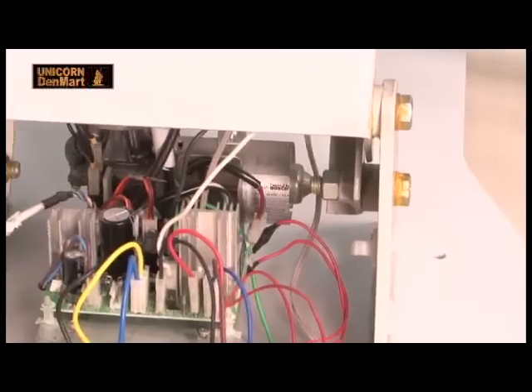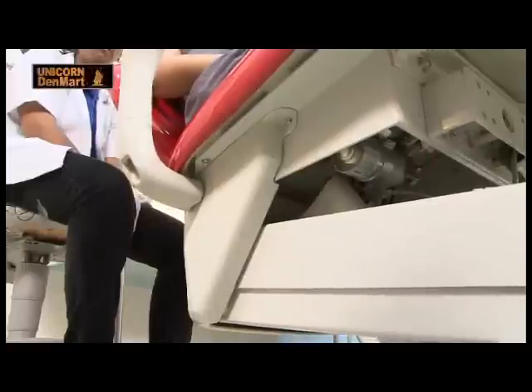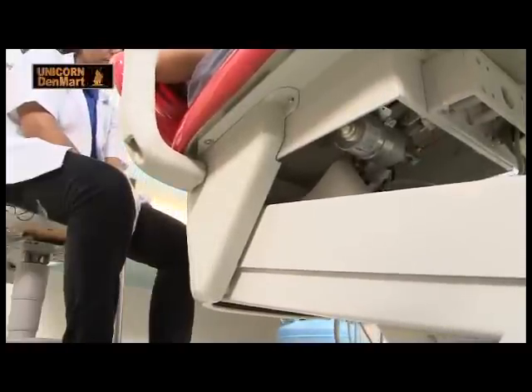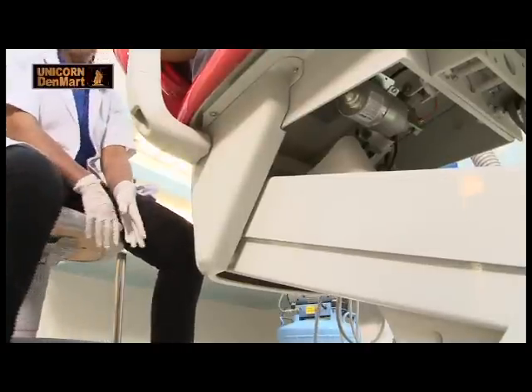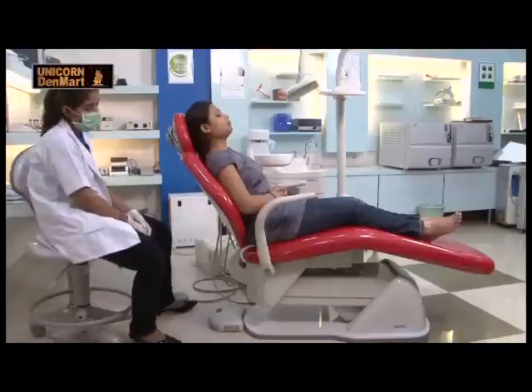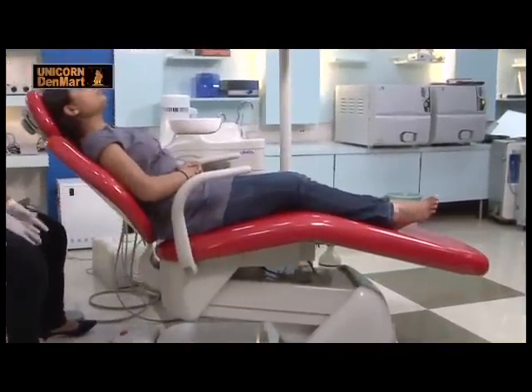The Bosch control DC operated motor controls and allows the chair to perform independent up and down movements for adjusting the height. There are also back and forth movements of the chair, providing increased visibility with the correct working position for the user to execute proper dental treatment.